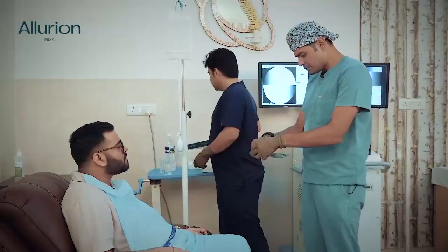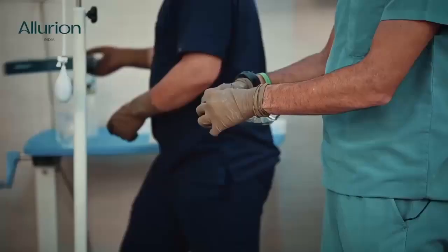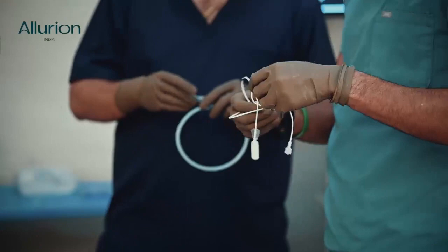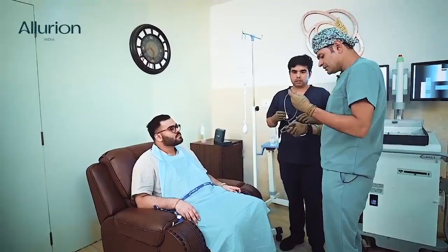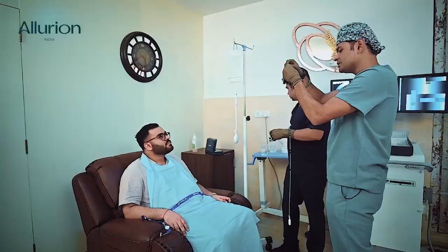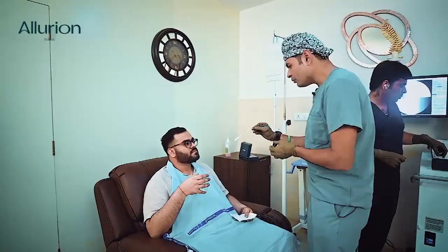I'll open this capsule in front of you to demonstrate what it is. That's the way we open it. Before putting in the catheter we will just load the stylet. The purpose of this particular stylet is just to make things a little bit easier for you.